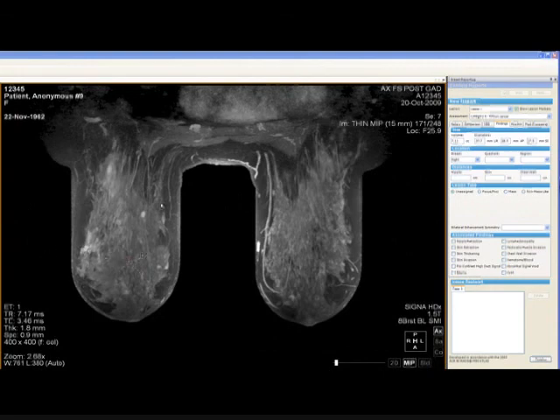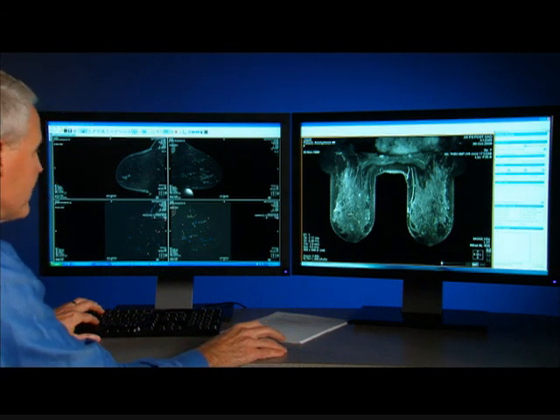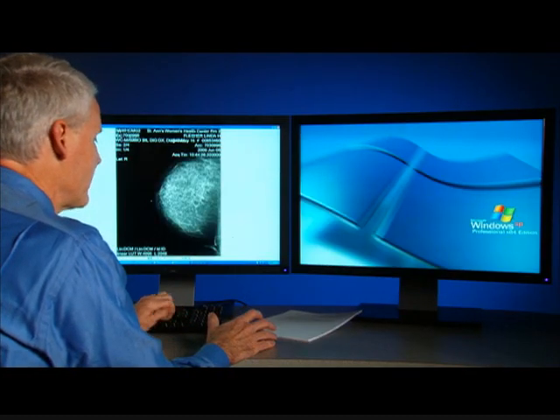If this patient is planning on breast conservation, then I think this would warrant an MRI-guided biopsy to make sure you weren't dealing with multicentric disease. In this patient's case, she did elect to proceed with mastectomy, which did demonstrate multicentric invasive ductal carcinoma with large areas of intervening DCIS.